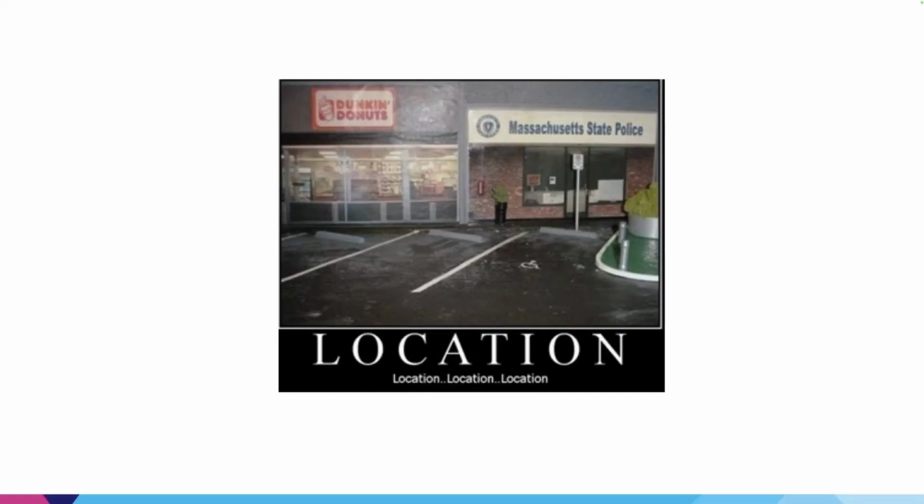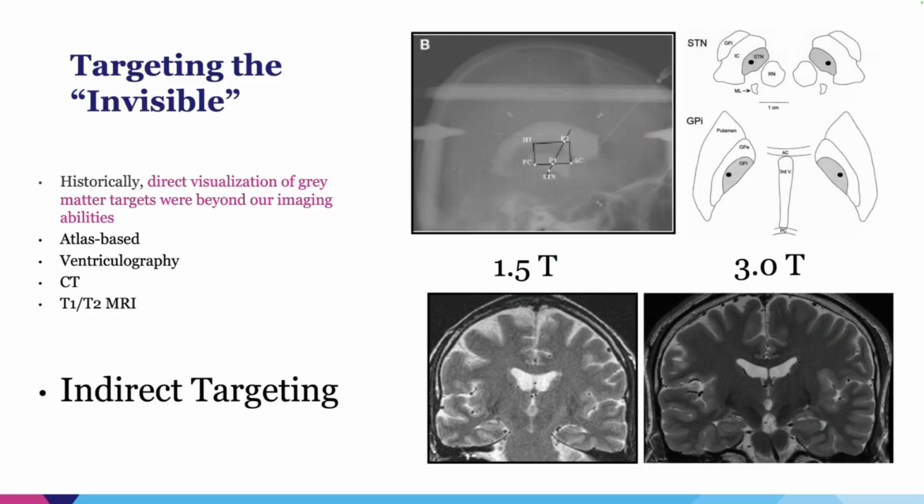Again, I'm not sure who is on this call, so if I go too much into certain basic stuff, I apologize. But DBS, like real estate, is about location, and ultimately our outcomes are determined by being both precise and consistent from patient to patient. Historically, these gray matter targets of movement disorder surgery were beyond our imaging capacity.